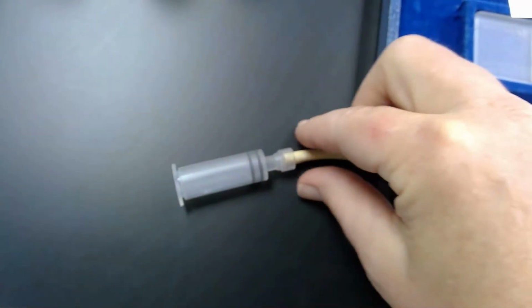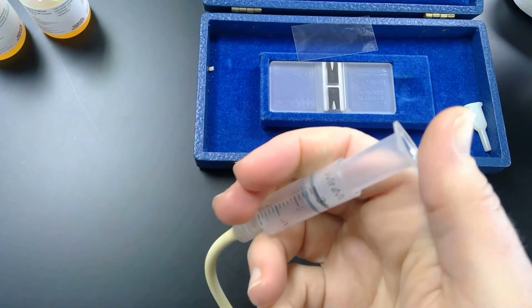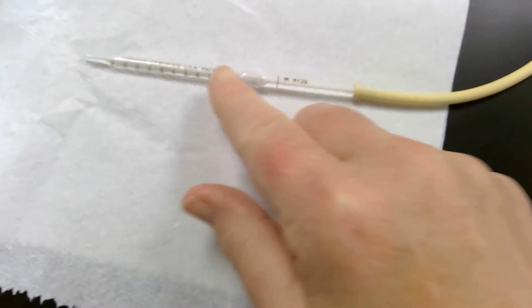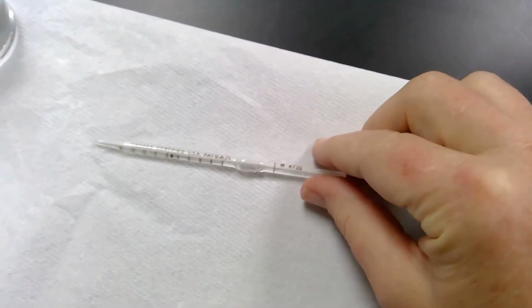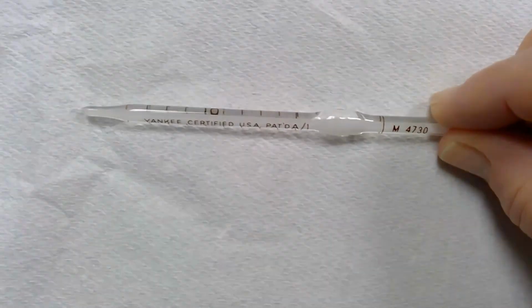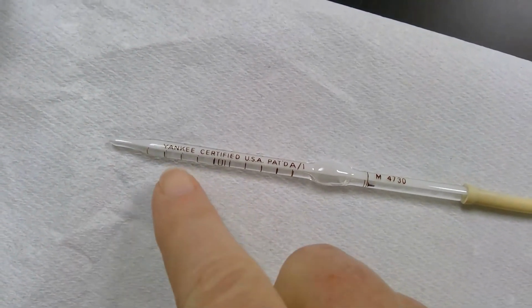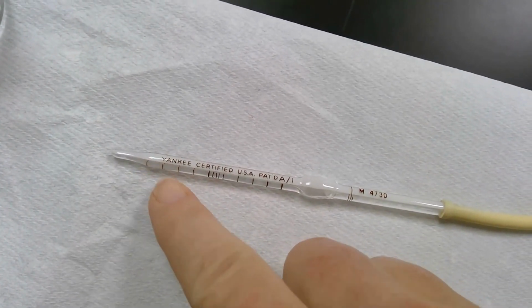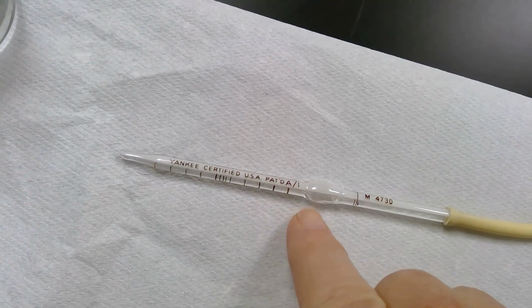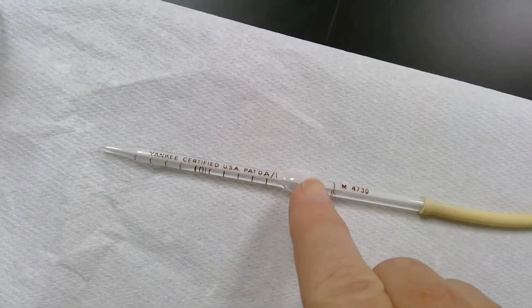And the way you do this, at the other end of the hose here, you have a syringe. So you just pull the top up to bring it in and you push it down to squirt it out. So we're going to pull some blood into here, then we're going to pull some water into here, then we're going to shake it to mix it up. Because water was the last thing you pulled in, the whole tip here is going to be full with water. So first we pull the blood in, and you have blood in the tip here. Then you pull the water in, and that water coming in pushes the blood up into the chamber, and some of the water goes into the chamber. You mix that up, you have your diluted blood in the chamber.